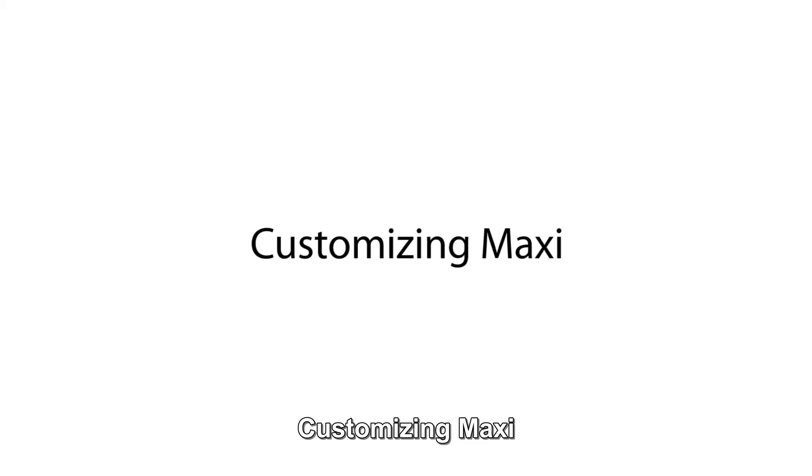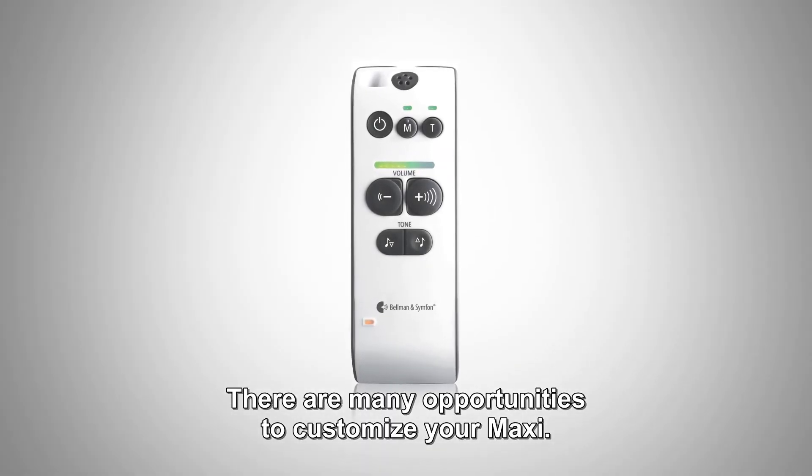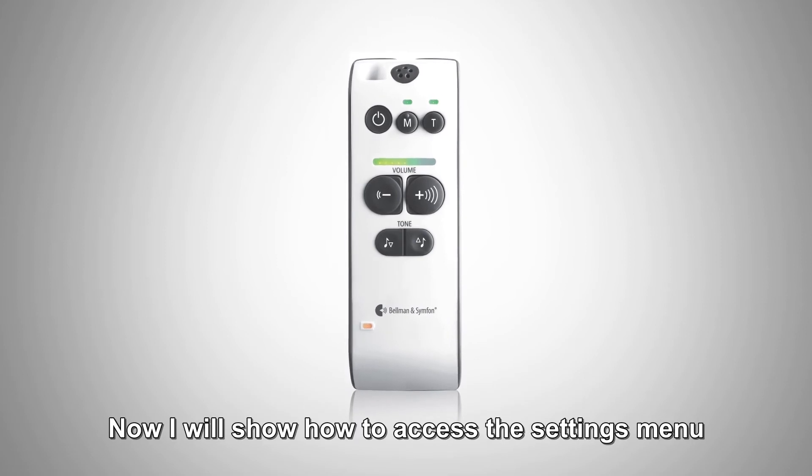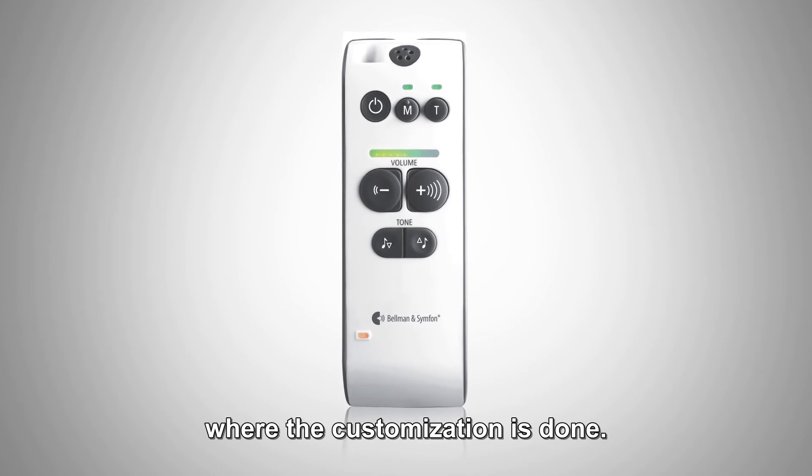Customizing Maxi. Introduction. There are many opportunities to customize your Maxi. Now I will show how to access the settings menu where the customization is done.